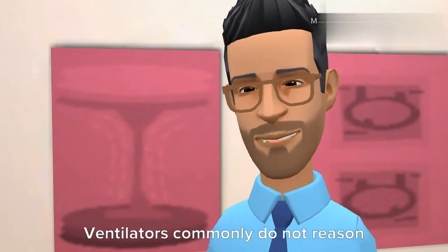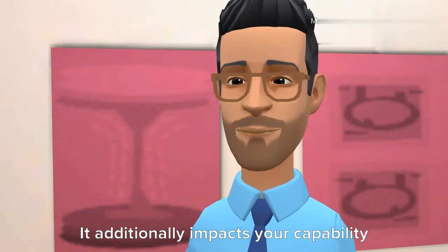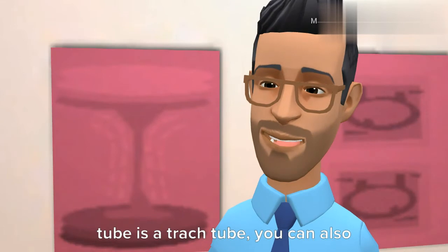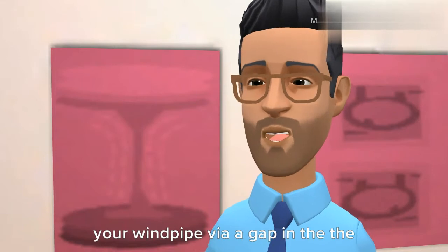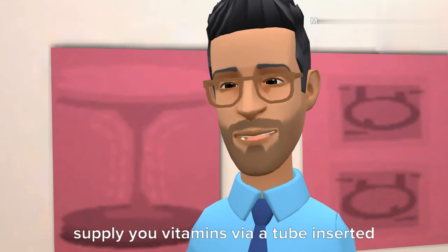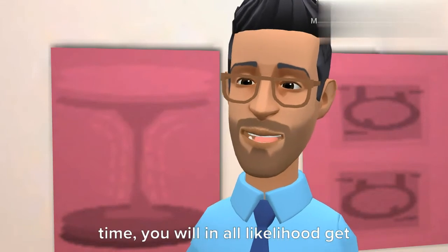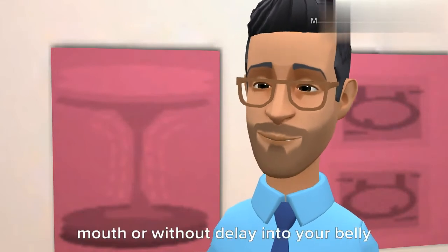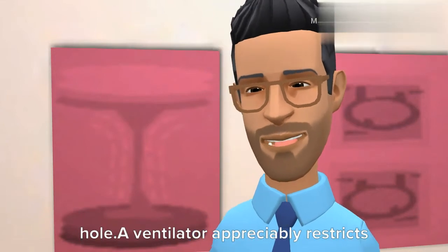Ventilators usually do not cause pain. The breathing tube in your airway might cause some discomfort. It also affects your ability to talk and eat. If your breathing tube is a trach tube, you may be able to talk. A trach tube is put directly into your windpipe via a hole in the front of your neck. Instead of food, your health care team may give you nutrients through a tube inserted into a vein. If you are on a ventilator for a long time, you will likely get food through a nasogastric, or feeding, tube. The tube goes through your nose or mouth, or directly into your stomach or small intestine through a surgically made hole.